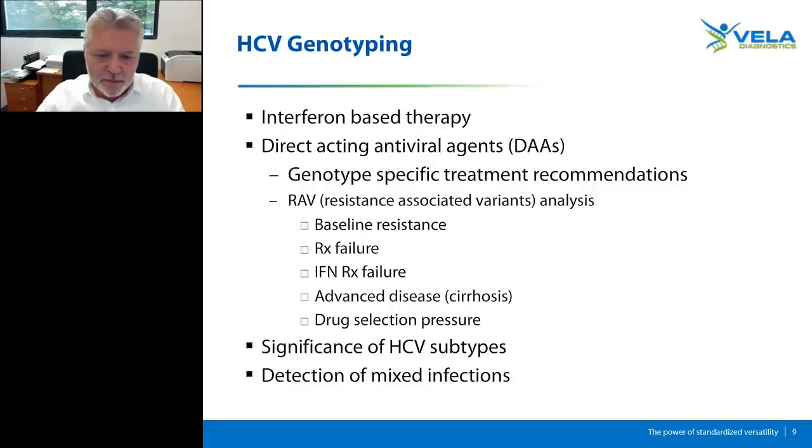And last but not least, importantly, in many patients we see mixed infections which are not readily detectable by line probe assays. That is important because mixed infections may change the regimen for treatment.